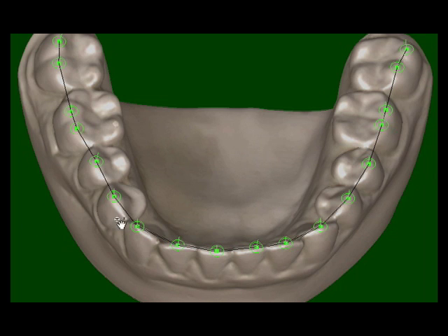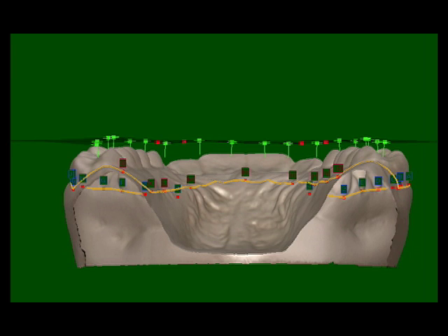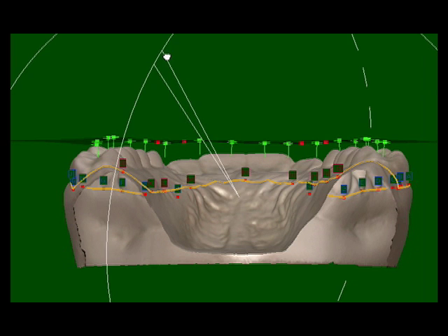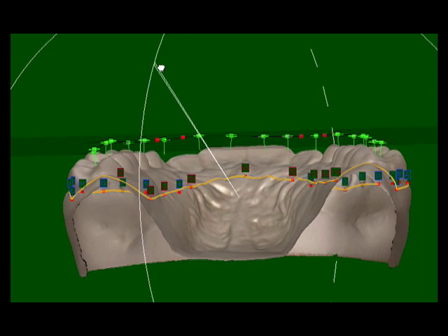For centric relation splints, the extent of the anterior and cuspid ramps is defined by placing markers on the contact line. Here we see a complete set of contacts on a lower model.